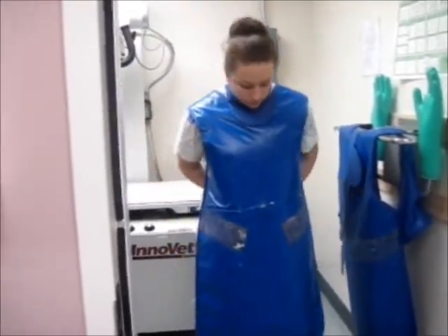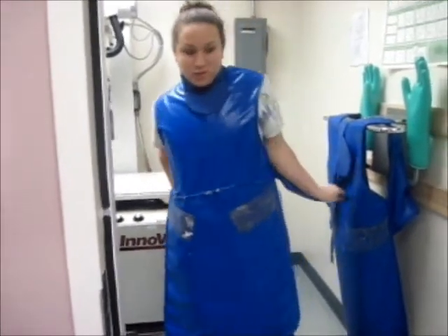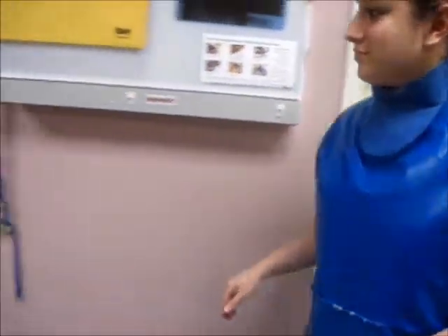You first want to put on all your personal protective equipment, which includes your thyroid shield, lead apron, and a dosimetry badge. If you are doing manual restraint, lead gloves would be needed also.